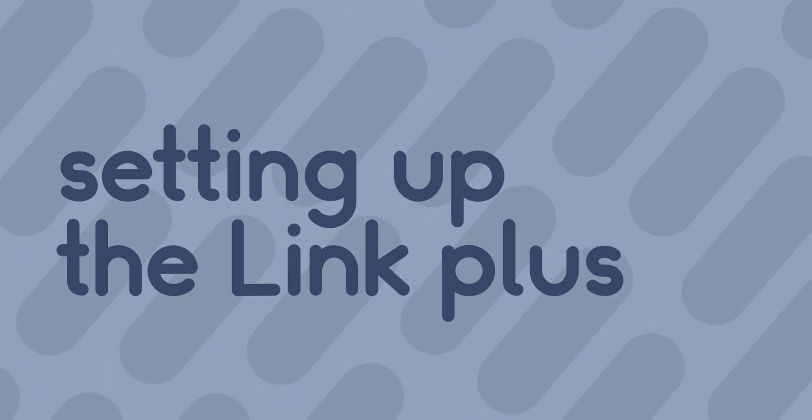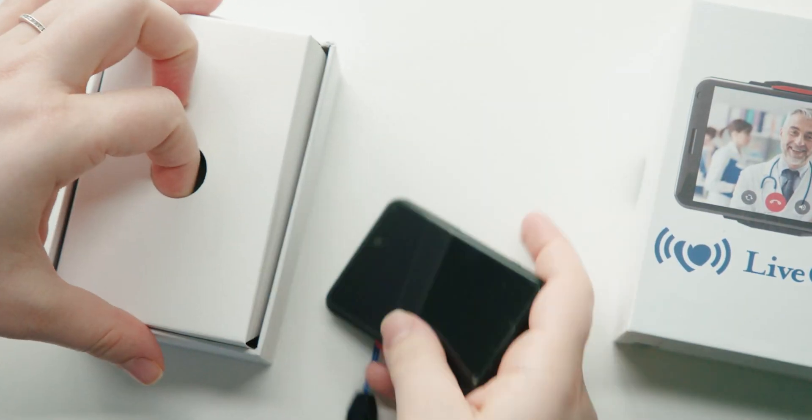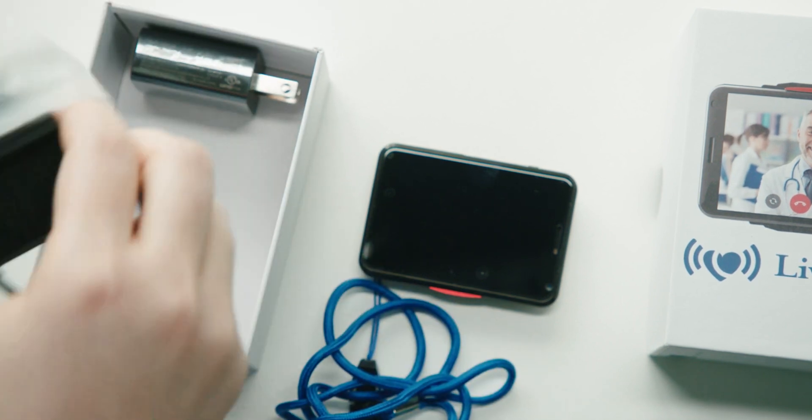In the box, patients will receive the Link Plus device, a docking station with power supply and a short blue strap.